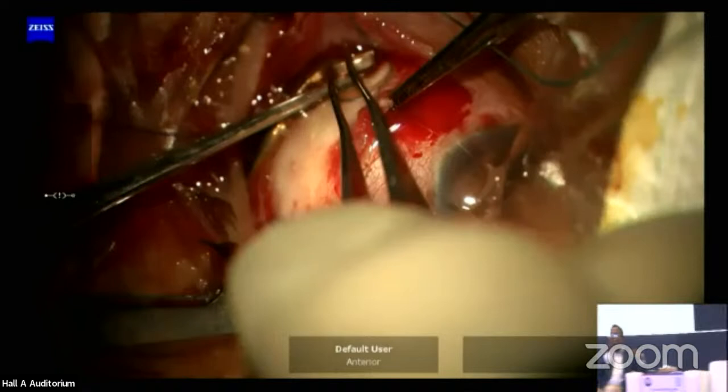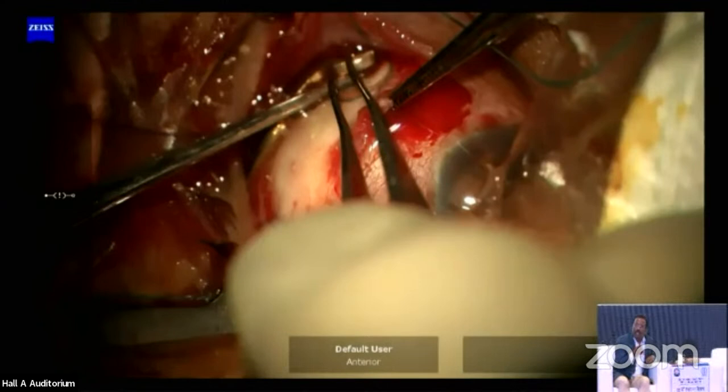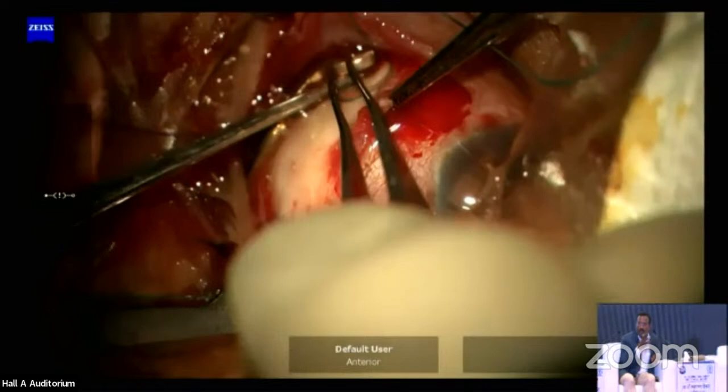Basically, as madam said, different radioactive materials can be used for plaque placement. Generally, different radiations like gamma rays and beta rays are used in plaque brachytherapy. I'm not going to go into other details. This ruthenium-106 is a beta radiation. Its penetrability is a few millimeters, not more than 15 mm maximum. Iodine-125, which is also possible to use for this kind of plaque placement, is a gamma radiation, which requires more shielding, and it has the capability of penetrating a little bit more into the tissue. So these are very important things.